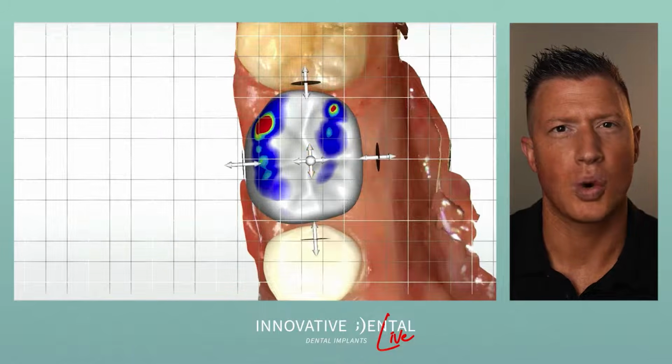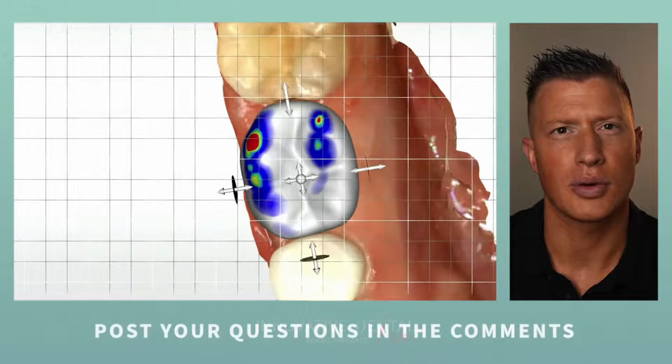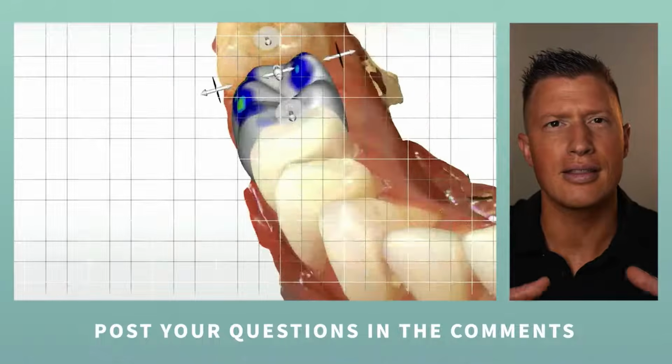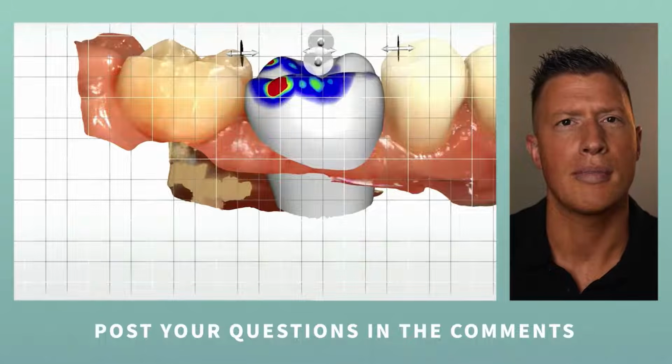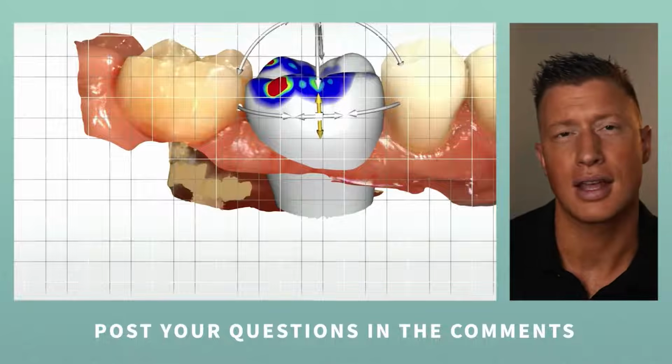And then I'm going to make sure that it's wide enough for the space. And then we need to make sure that this lines up correctly with, we call them marginal ridges, but basically just the height of that connection or that space between the teeth. We want to match the height of the adjacent teeth. We don't want to have an implant crown that's sitting down too low.